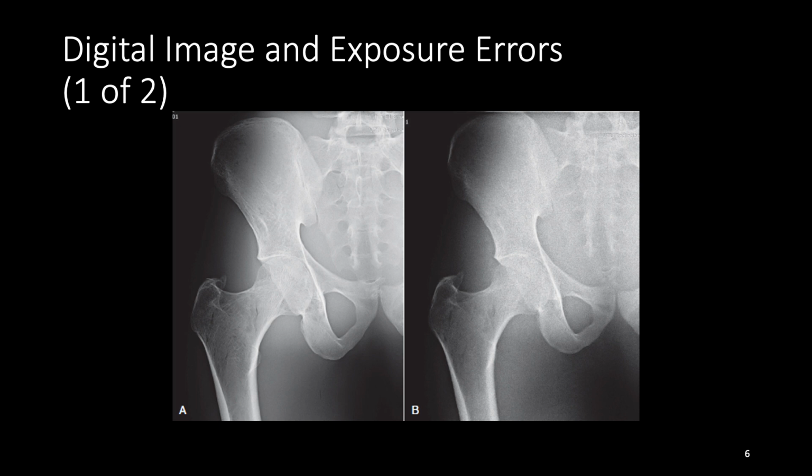If the mAs is too low, which is low exposure to the digital IR, image brightness is adjusted during computer processing, although there may be increased quantum noise visible within the image as well. So the radiographer should be diligent in monitoring the EI values to ensure that quality images are obtained with the lowest possible radiation dose to the patient.